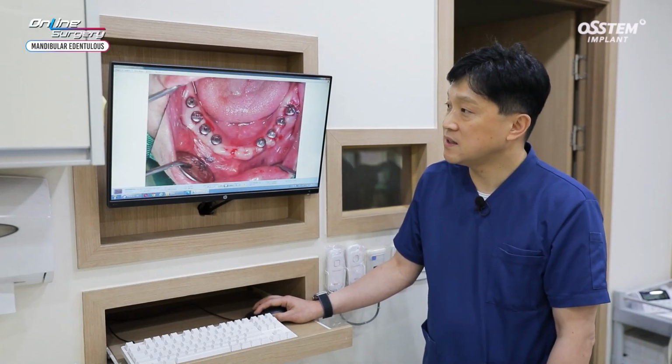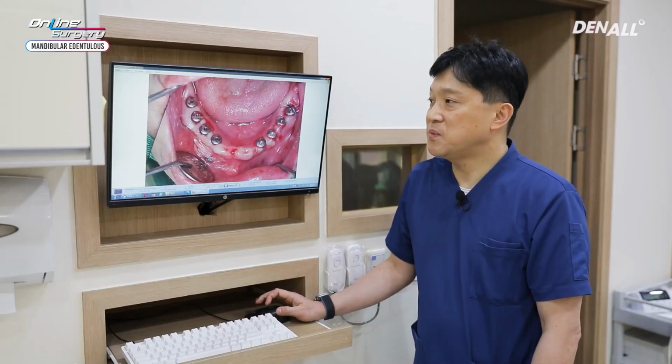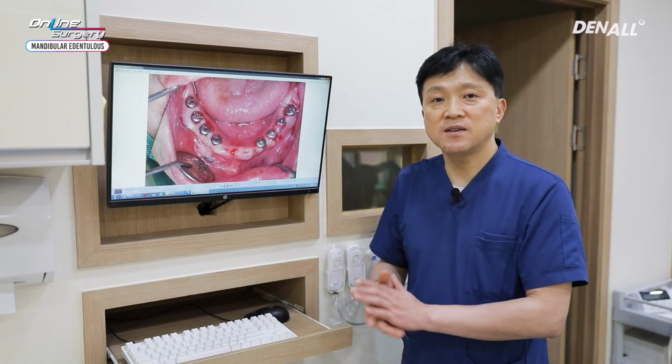This is mirrored image, so it is the opposite. This is the right side, and only in the area where immediate implant placement was performed, collagenated bone graft was used, AOS collagen was used. Stabilization suture was performed. In this clip, I would like to emphasize the following.